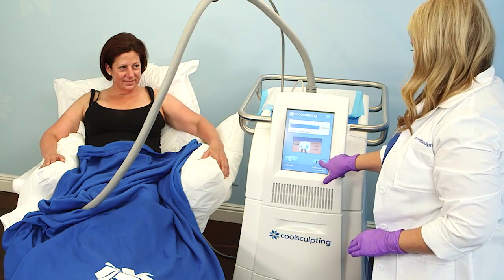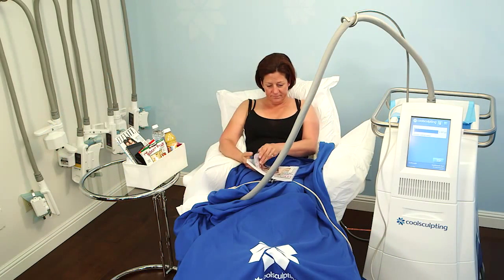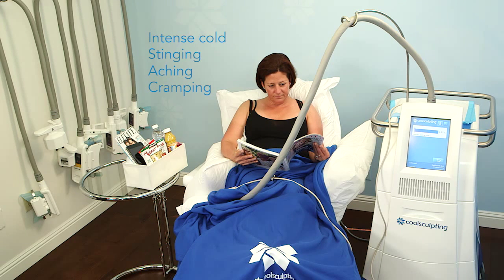After the patient is in position, engage cooling. Patients have reported feeling a heightened sensation of intense cold, stinging, aching, and cramping with the CoolSmooth applicator. Educate your patients and let them know that it may take longer for this treatment site to become numb in comparison to the vacuum applicators.